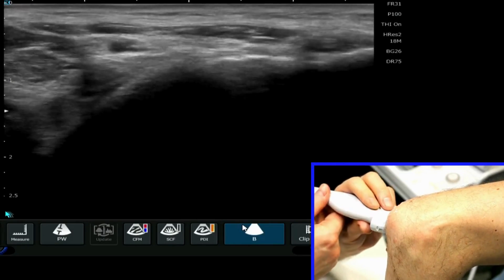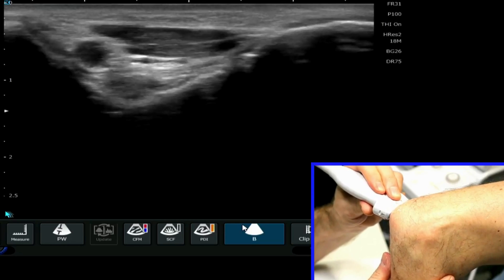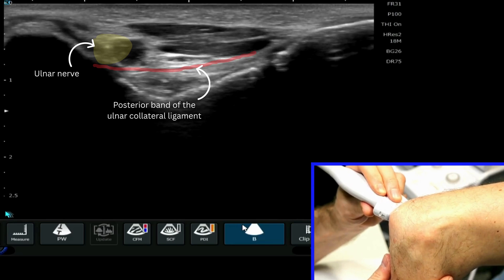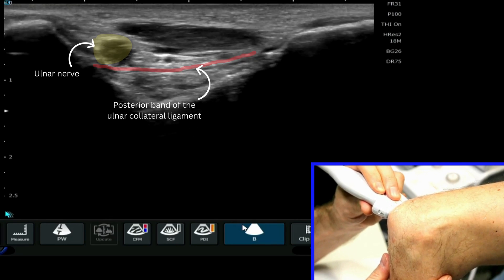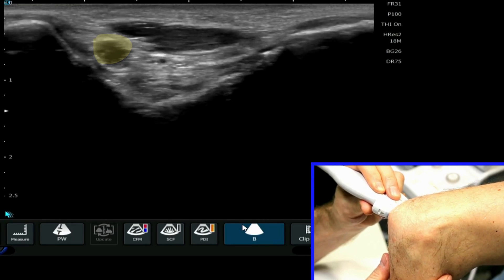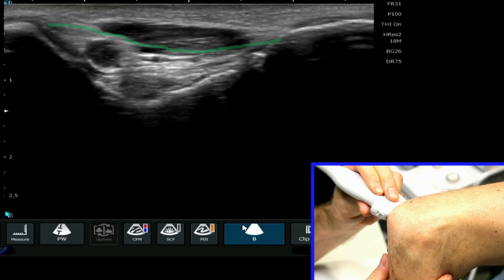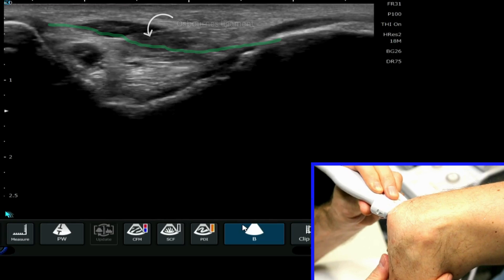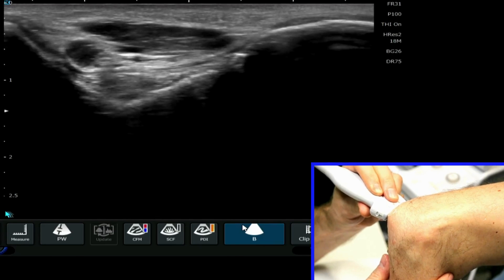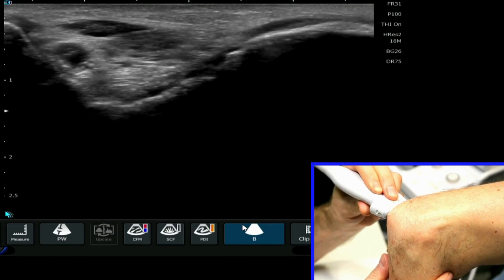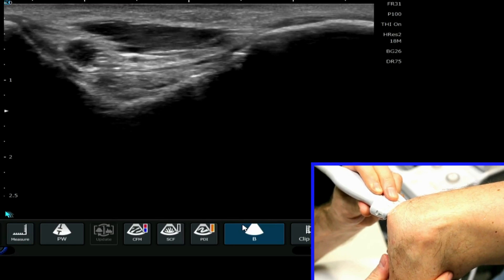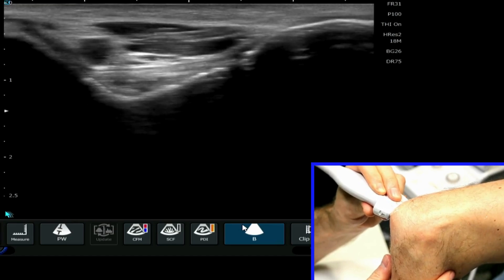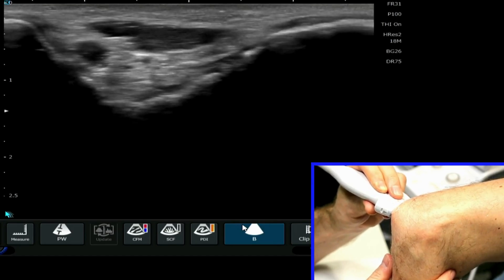Coming back up to the cubital tunnel, we can see the posterior ulnar collateral ligament running just underneath the ulnar nerve. If I tilt the probe just slightly, sitting just above the ulnar nerve, we can also see Osborne's ligament, which forms the roof of the cubital tunnel more superficially. These are the key structures you can look at in the cubital tunnel.